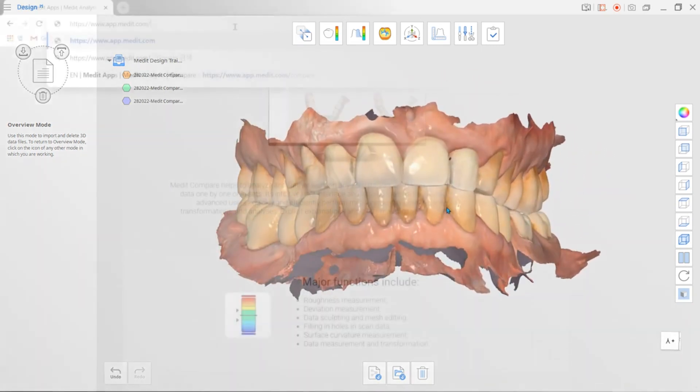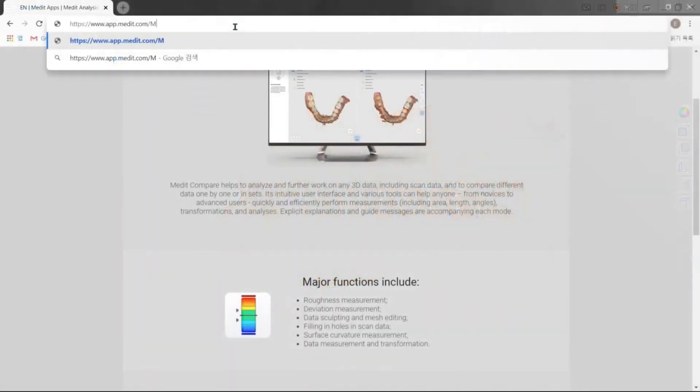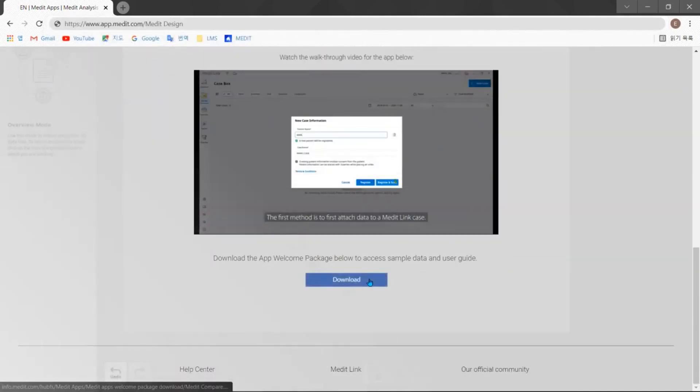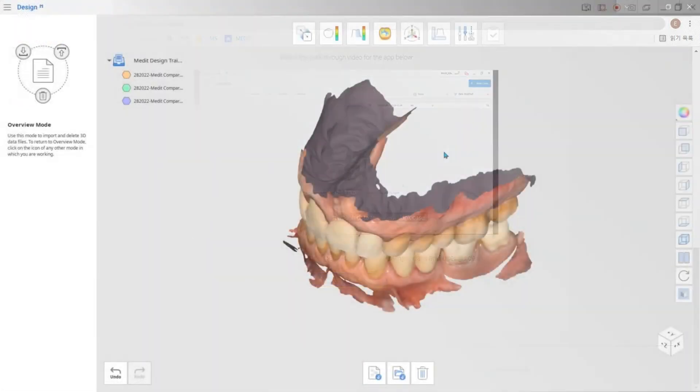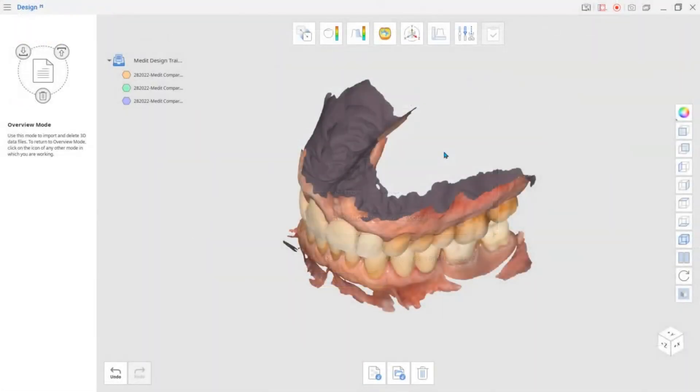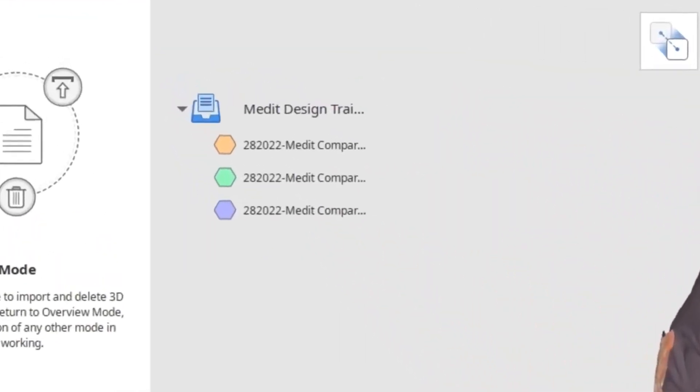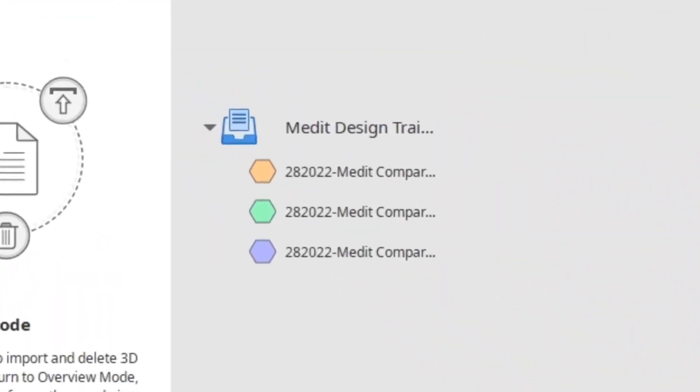You can also use various sample data provided by Medit in the app welcome package. Imported 3D data will be listed in the data tree on the left and color coded for easy management.